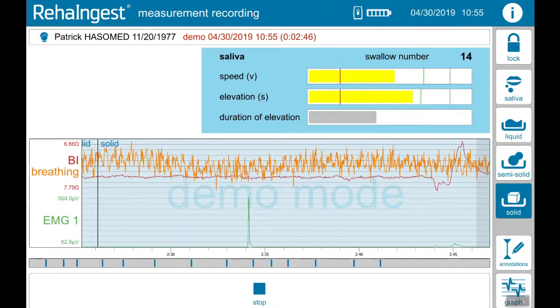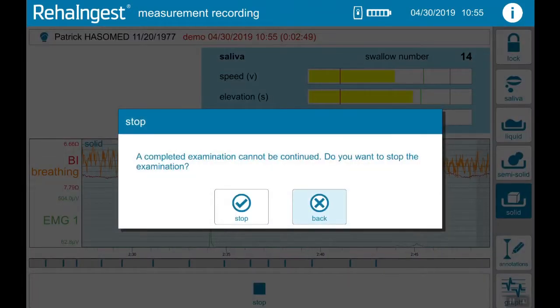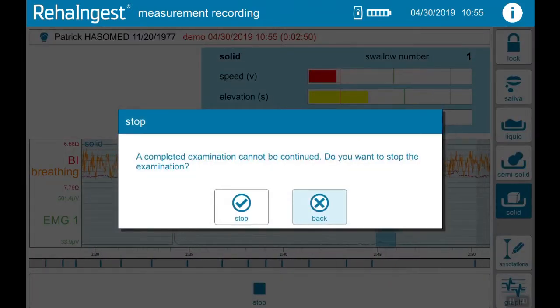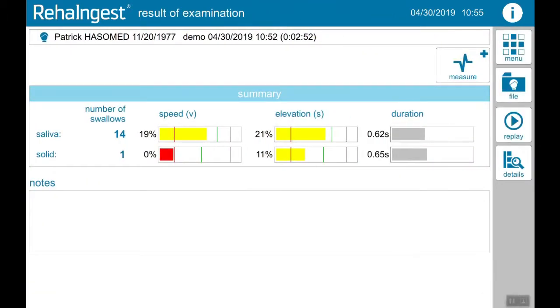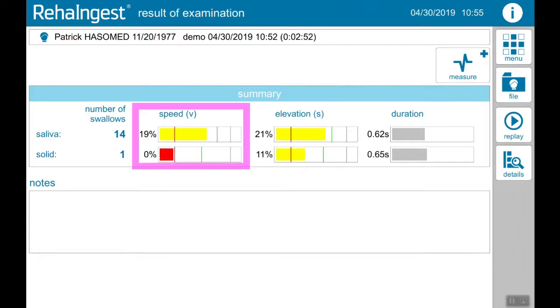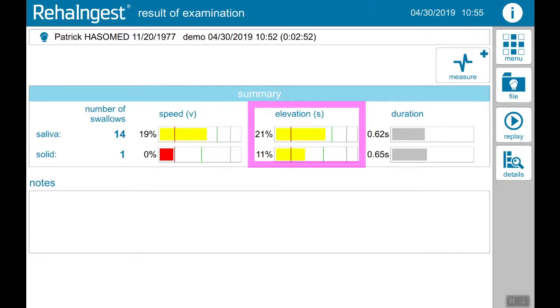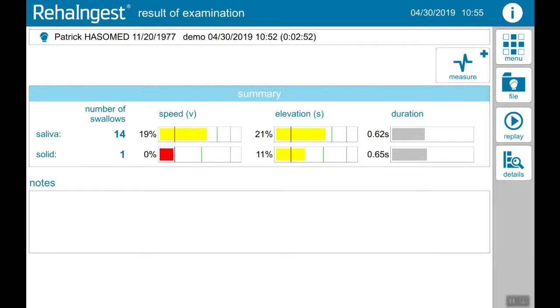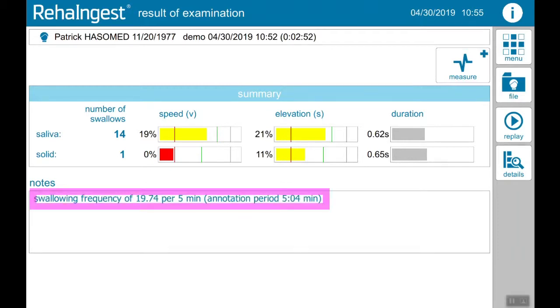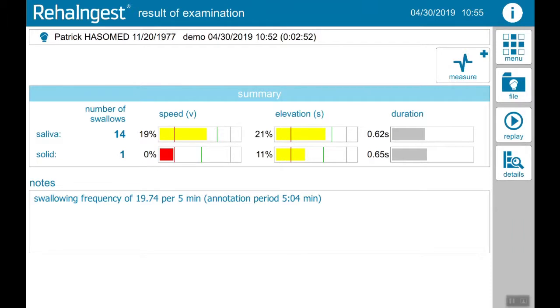If therapy is over, tap stop and confirm the completion of the measurement. You are automatically guided to the results screen, where you see an overview of average speed, elevation and duration of the recorded swallows. If the record was longer than five minutes, an average swallow frequency will be shown.